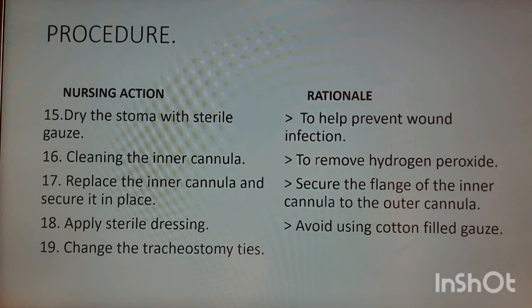Next, apply the new tape. First, we have to grab the slit end of the clean tape and pull it through the opening on one side of the tracheostomy tube. Pull the other end of the tape securely through the slit end of the tracheostomy tube on the other side. Tie the tape at the side of the neck in a square knot. Alternate the knot from side to side each time tapes are changed, in order to prevent irritation and aid in rotation of the pressure site.